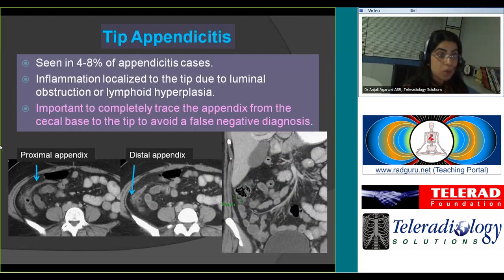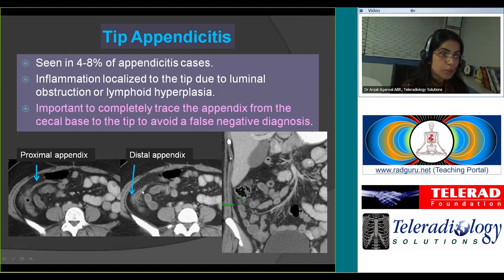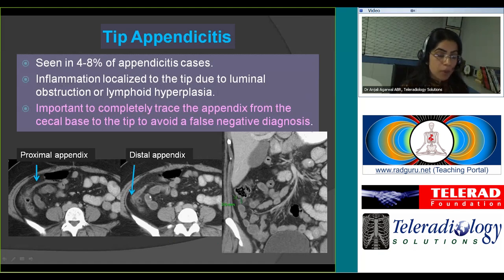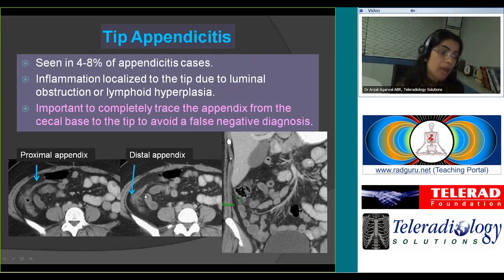Tip appendicitis is seen in about 4 to 8% of appendicitis cases. The inflammation is localized to the distal tip of the appendix, due to luminal obstruction secondary to an appendicolith or lymphoid hyperplasia. Notice a normal-looking proximal appendix and a thickened fluid-filled distal appendix with fat stranding — the appendiceal tip measures 9.8 millimeters. It is very important to trace the entire appendix so we do not miss cases of tip appendicitis, as these can be quite subtle in patients with very long appendices.